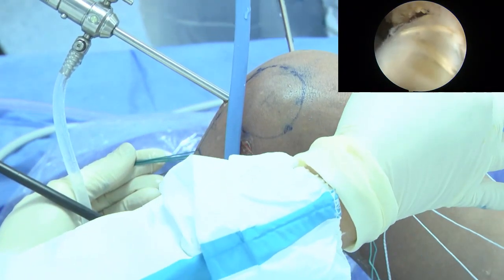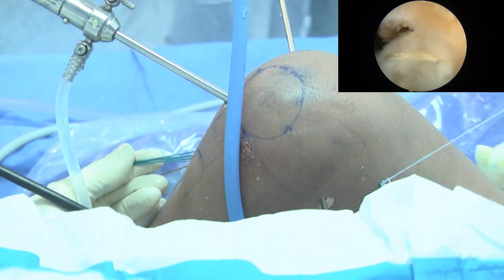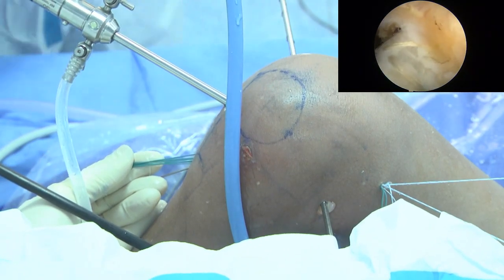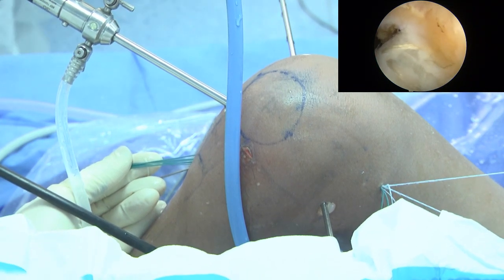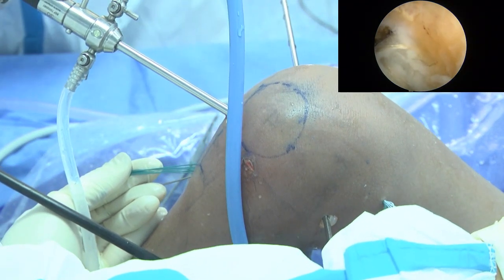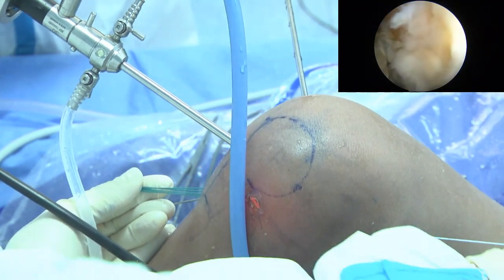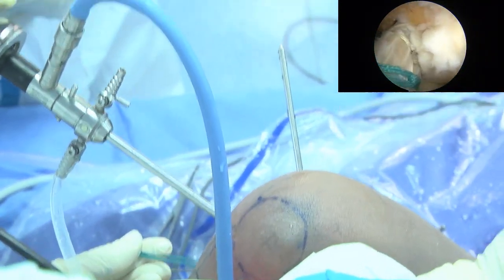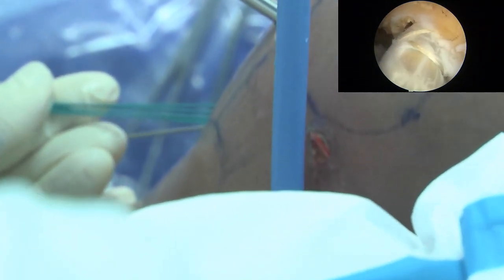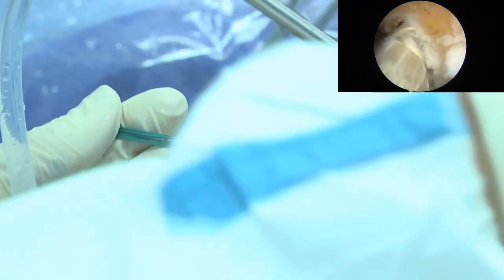Now you change from the tip to the center because there will be 2 loops. Look at this. This is the first loop for pulling the button. Okay. So there's another loop that is closer. You put your hand like this. 那大家注意看我手上的操作。这个中间的线呢，它不是一股线到底的，中间有好几段。第一段呢是个线环，是个指环。指环呢就是手指勾住之后，整个结构就会往外带。那中间呢就是两条线，两条线也是可以整个手掌包着这个线环的 U 型端来拉移植物。Very good. And then you pull this using some gauze or something soft protect your hand, right? Okay, and then pulling.